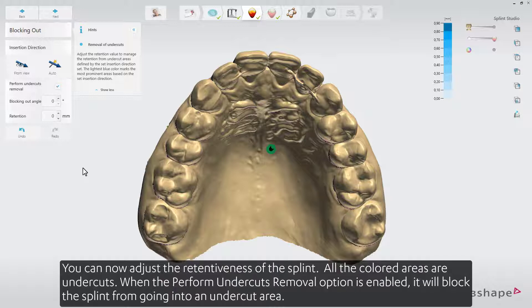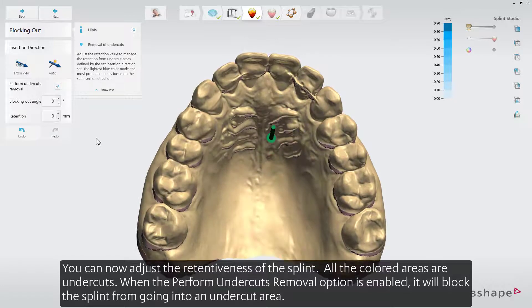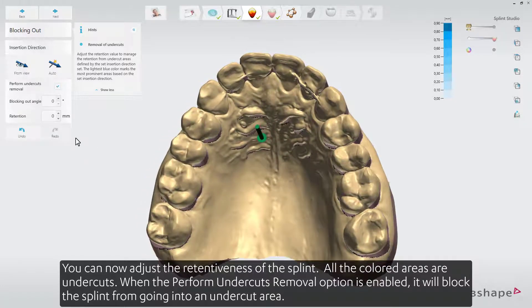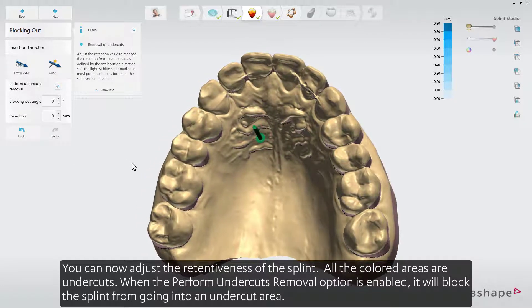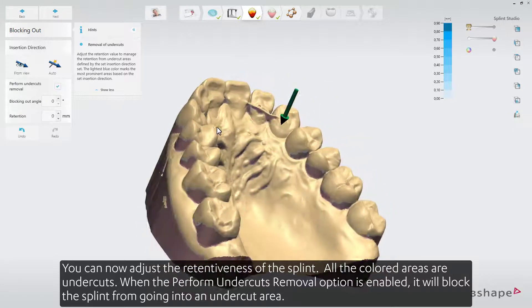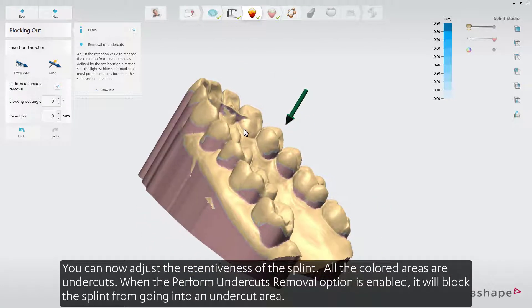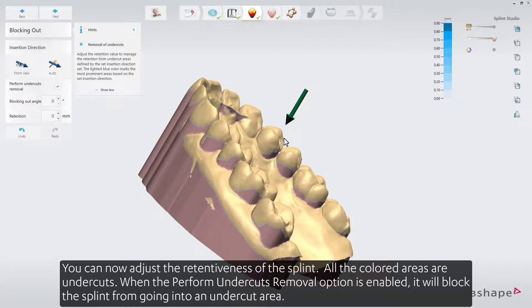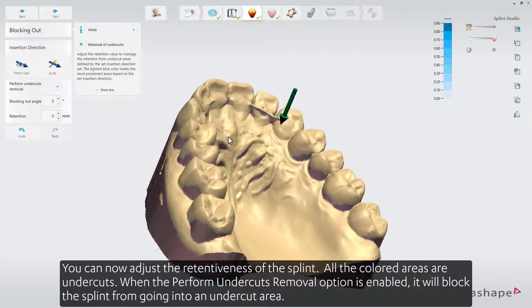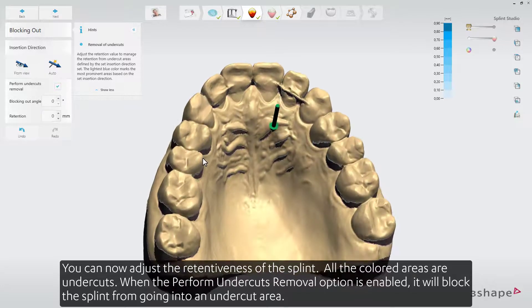You can now adjust the retentiveness of the splint. All the colored areas are undercuts. When the Perform Undercuts Removal option is enabled, it will block the splint from going into an undercut area.